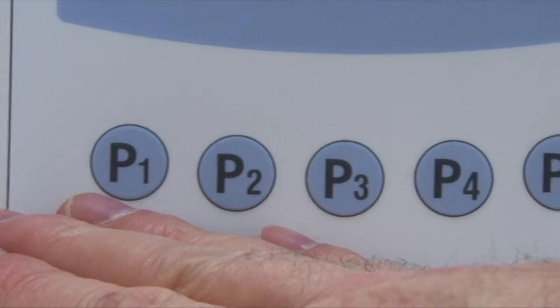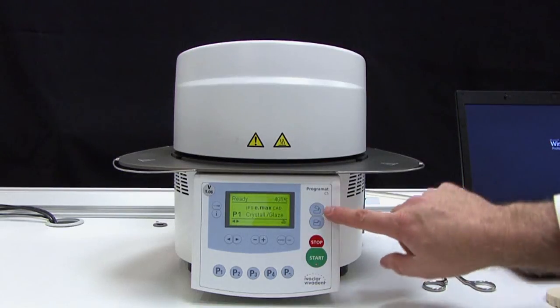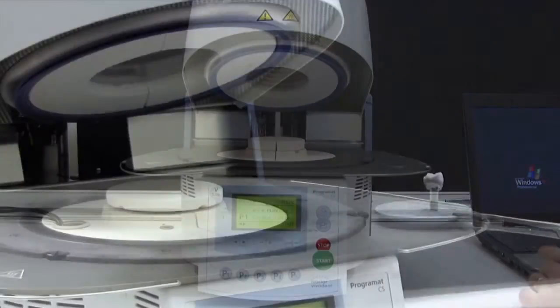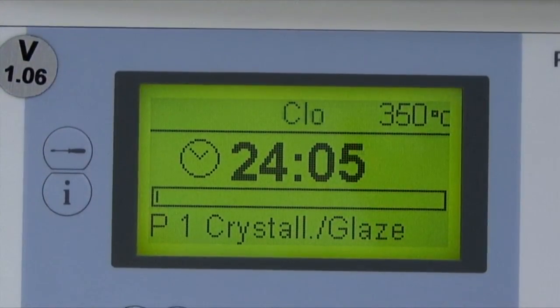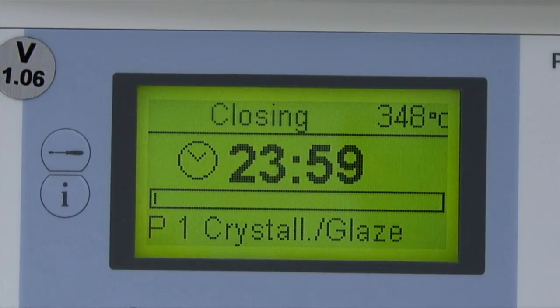Select the program key of the desired program. Open the furnace head and place the restoration on the firing tray, then enter the furnace. Press the start key. Note that the program can only be started with the furnace head open. The firing process is indicated in the firing curve display.